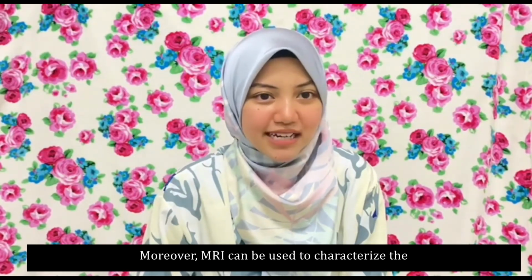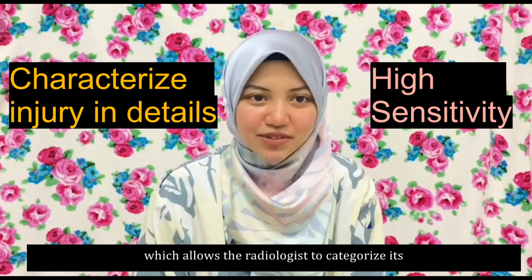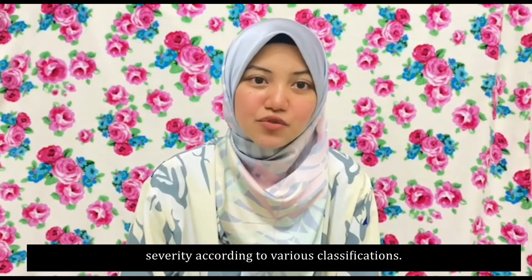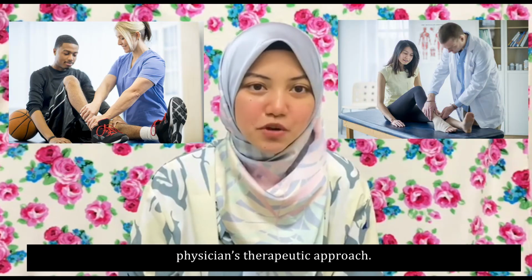Moreover, MRI can be used to characterize the muscle injury in detail and with high sensitivity, which allows the radiologist to categorize its severity according to various classifications. Therefore, this classification guides the sport physician's therapeutic approach.